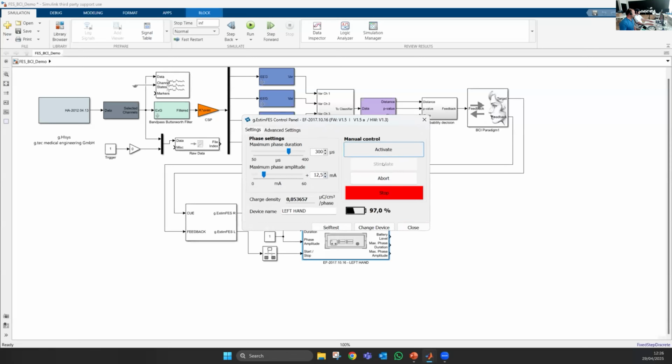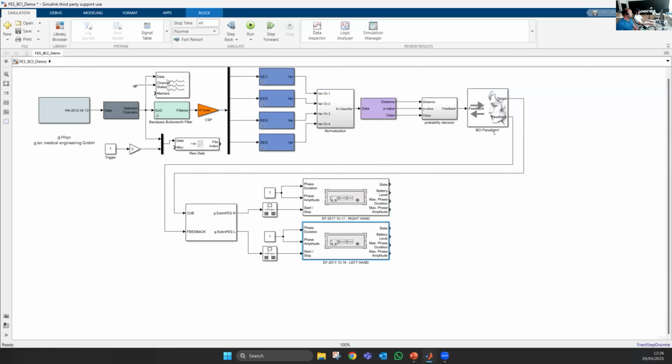So we activate, we stimulate. That's fine. So Evgeny's task is now to concentrate on the stimulation and on the motor imagery. He will get the task: you imagine a movement of the left or right hand side, and according to that, he should try to imagine the movement. This will take a couple of minutes now, and I will explain some more details in the meanwhile.